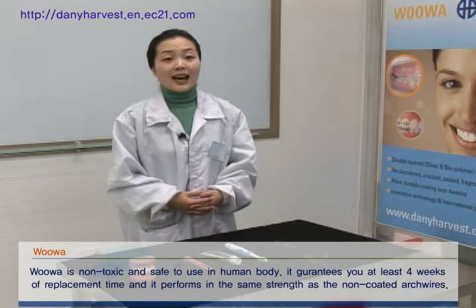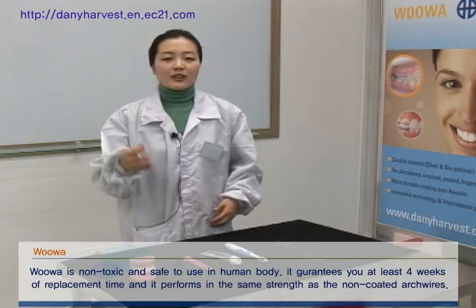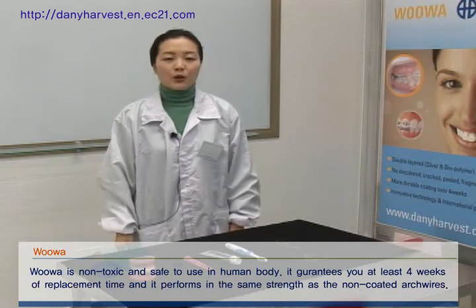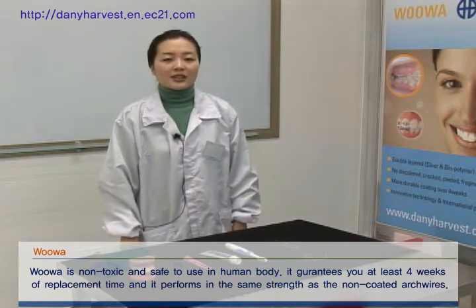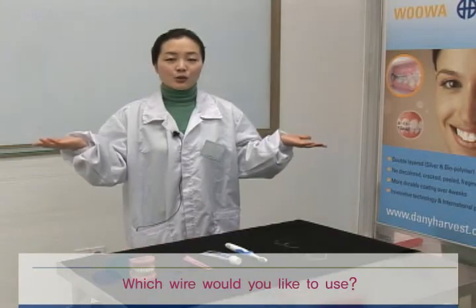Woowa is non-toxic and safe to use in the human body. It guarantees you at least four weeks of replacement time and performs with the same strength as non-coated archwires. Which wire would you like to use?